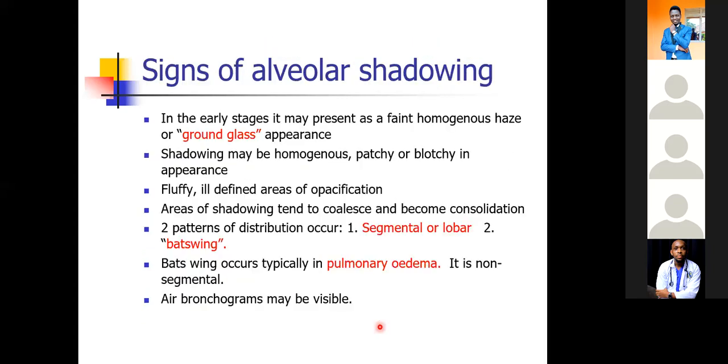This is still describing more or less the same thing that we have already talked about. So if we look a little deeper into disease processes in the airspace or the alveolar space, those opacities, we can identify some patterns.